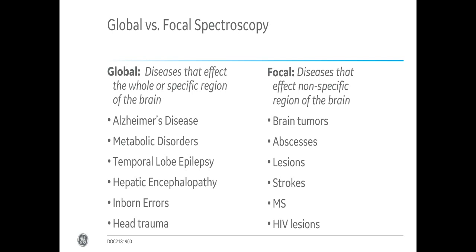with these, you can already address a large number of diseases where it's easy to place the voxel because in each of the diseases you know your voxel location and how big the voxel needs to be to get high quality. So it's a simple acquisition that can be done.